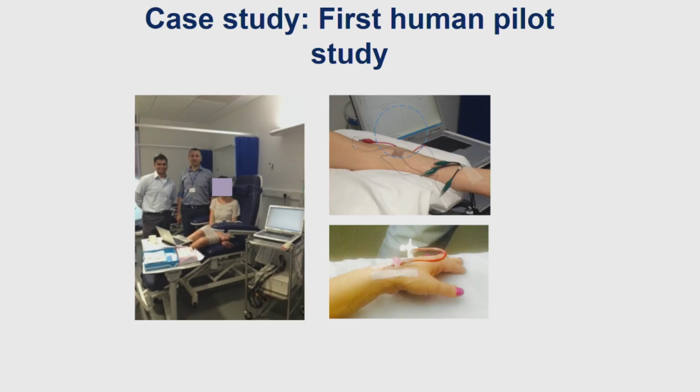All right, I think I might have already shown you this picture. This is a picture from the first case study that we did, just to do a quick recap. Again, look at the instrumentation here, right? This is the potentiostat, a huge CHI potentiostat that we have, a device which has been inserted there. You can see we are still using crocodile clips there with wires coming out of the device. This was very, very crude, but for a first try back in 2013, 12 years back, I don't think this was a bad try.